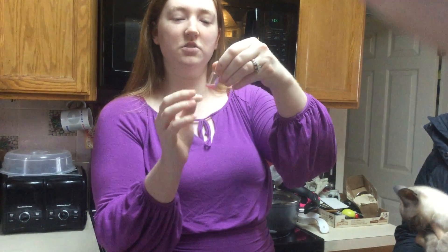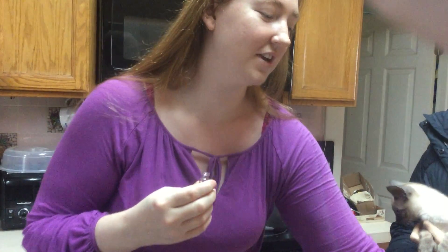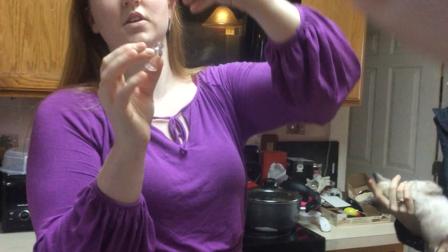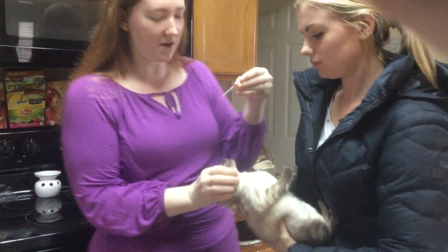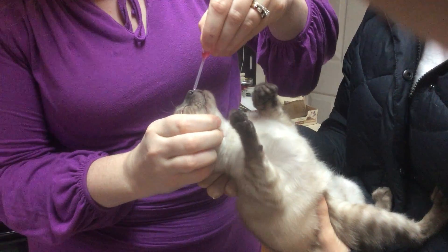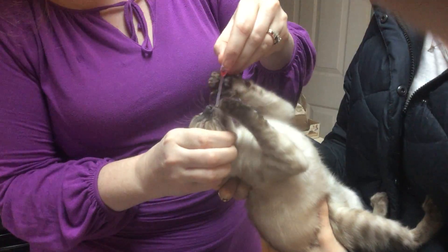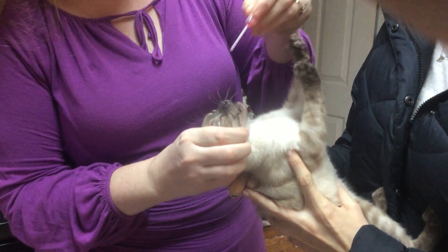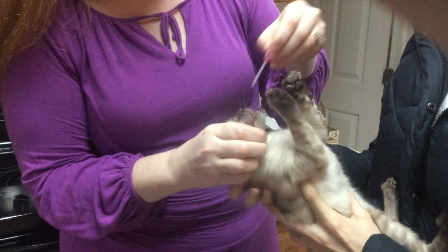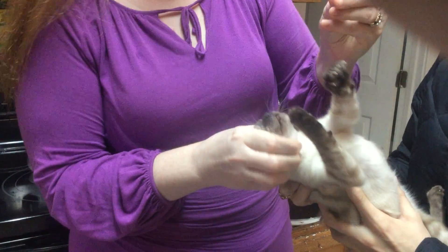The tricky part is that you're going to suction it all up in the pipette, but then you need to give about half in each nostril. Trying to judge half in each nostril while you have a cat that wants nothing to do with you is the most interesting part. You have to scruff her, and if you have her tilted slightly upside down that should help. The nostril is pretty small — put half inside one nostril, half inside the other. It's okay that it's going down their throat and that they're drinking some of it; it's getting into their nasal passageways.